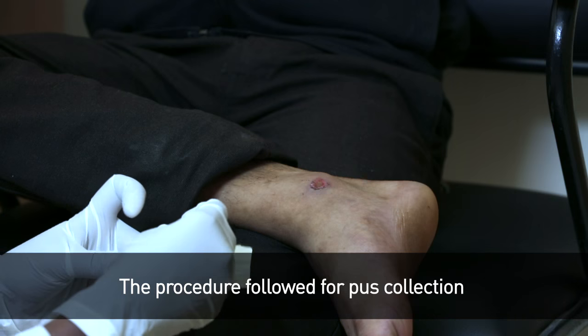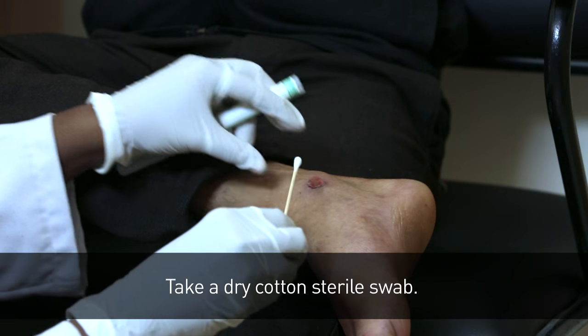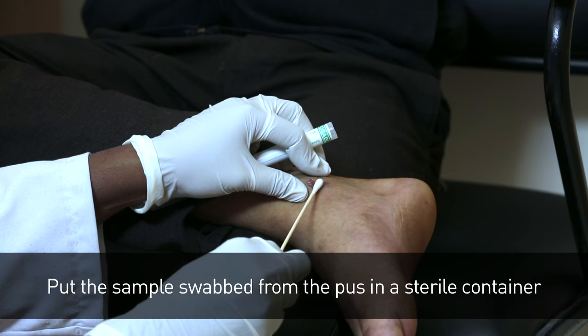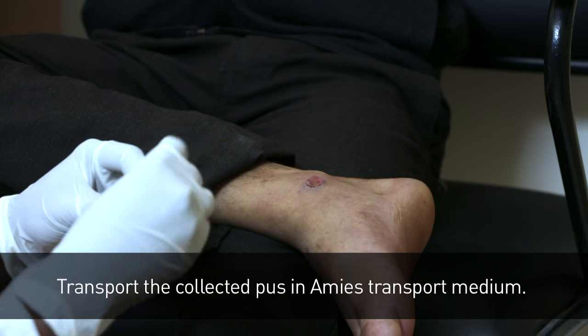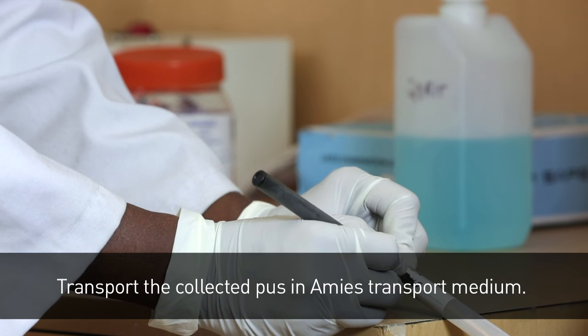The procedure followed for pus collection. Take a dry cotton sterile swab. Collect the pus swab from both the pus surface and pus margin. Put the sample swabbed from the pus in a sterile container and label the sterile container. Transport the collected pus in Amies transport medium.